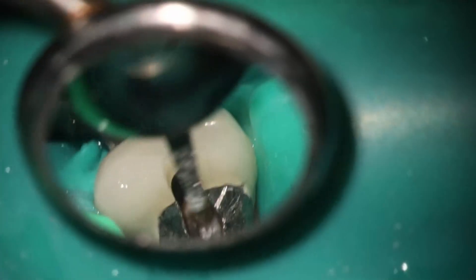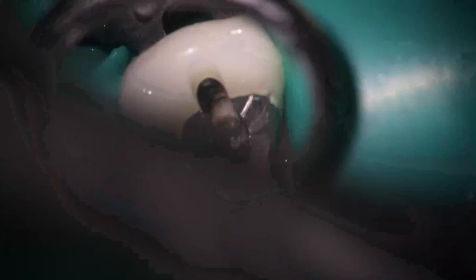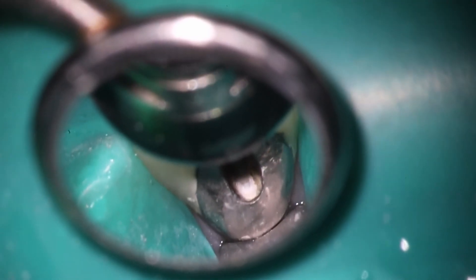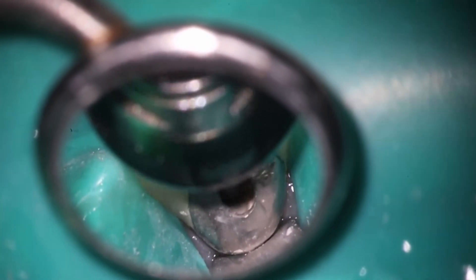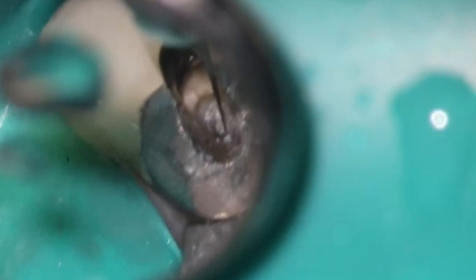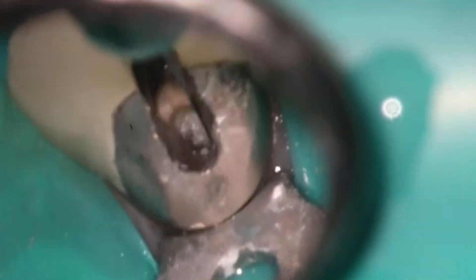What we saw was they accessed the tooth, almost perforated, but calcium hydroxide was placed not even in the chamber — just in the tooth structure itself. This is what we want to try and avoid. The way we do this is by readjusting the access so that it is in the long axis of the tooth through the incisal edge.